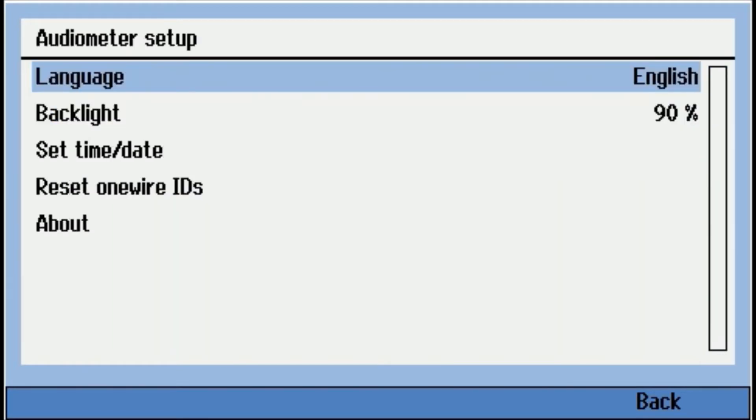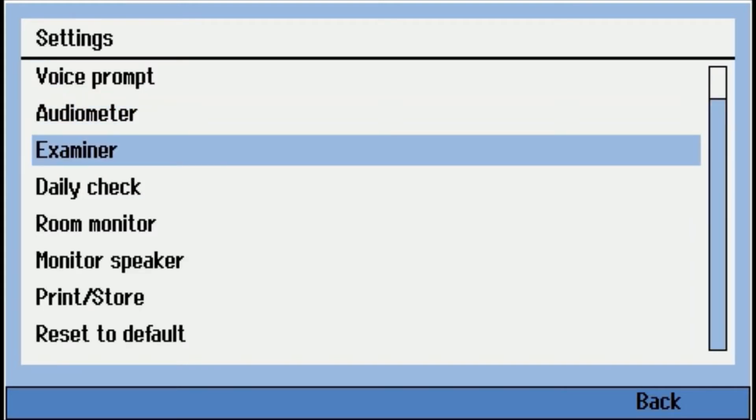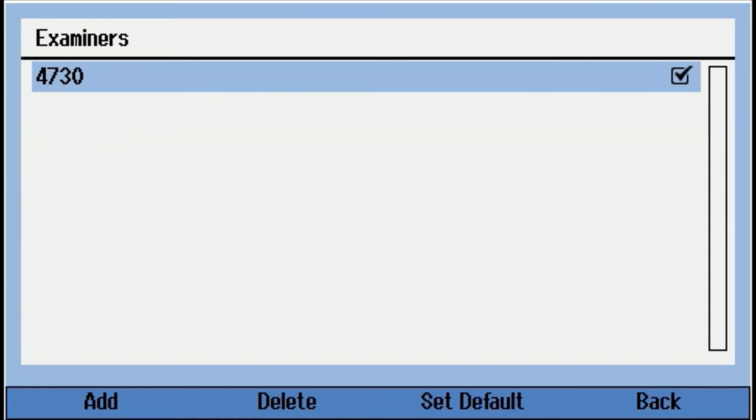Audiometer setup itself. So you can set the actual language, so what the settings, what the different menus in the audiometer will show up as. The backlight, so the screen brightness. Date, time. Examiner. So you can set up different examiners. So everybody would get a number code.